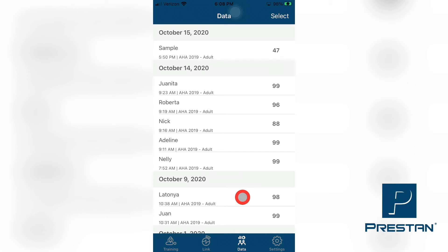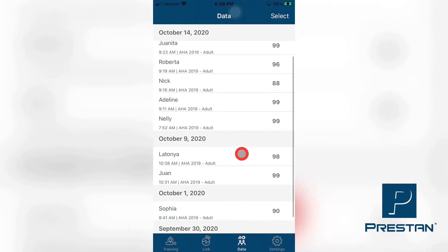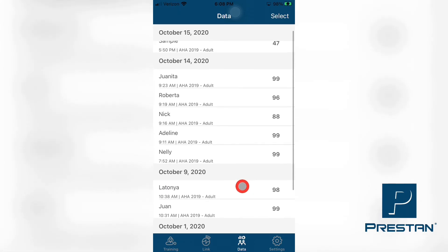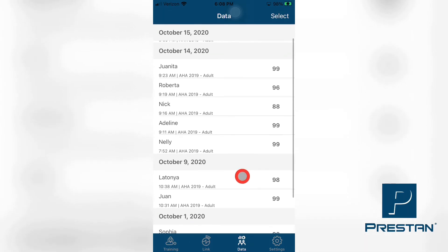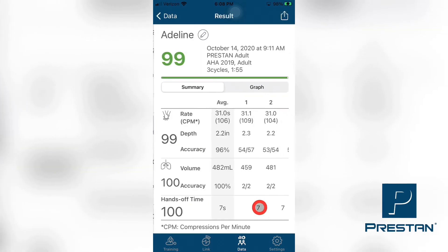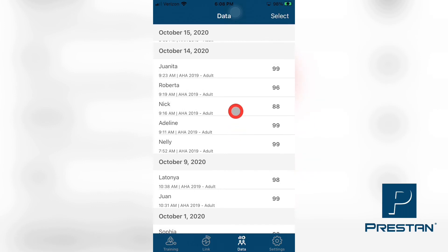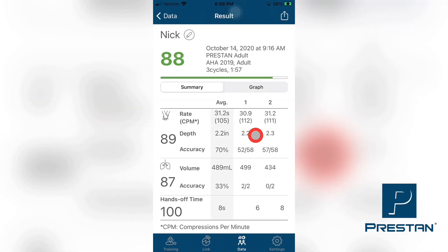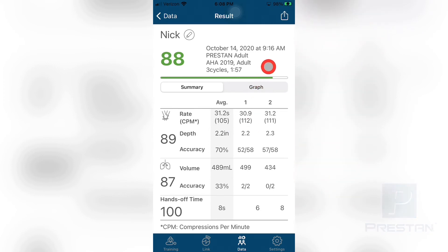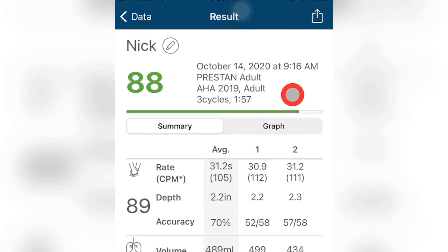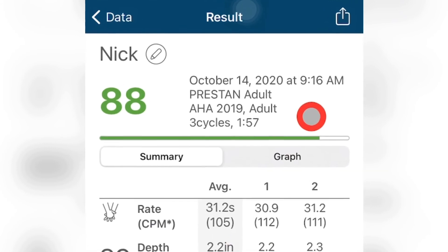It will also show the date and time the data was collected, the guideline used in the training, and the overall score the student achieved in the training session. To review the detailed data for any of the individual students, select the mannequin by tapping on the name. This will open up a window where you can dive deeper into the details of the session to see specifics on how well a student performed. At the top of the page, you will see the overall session details that will include the name used for the mannequin, the date and time, the device used in the training, the guideline used, and the overall combined training score achieved in the session.